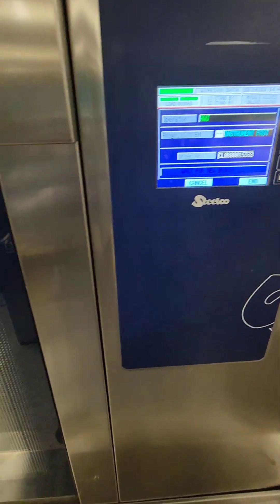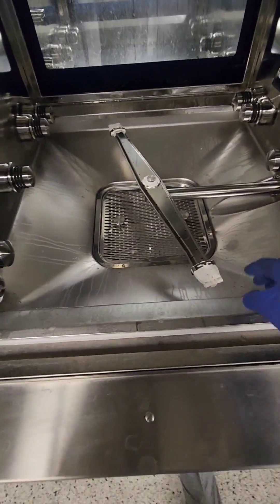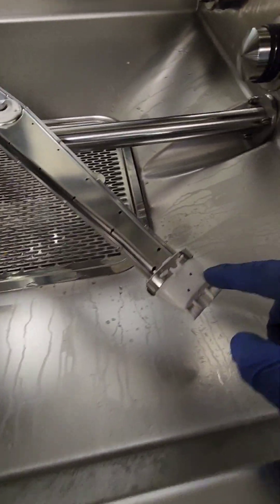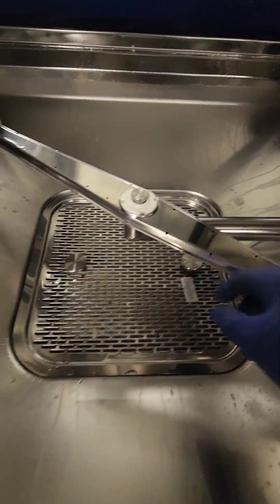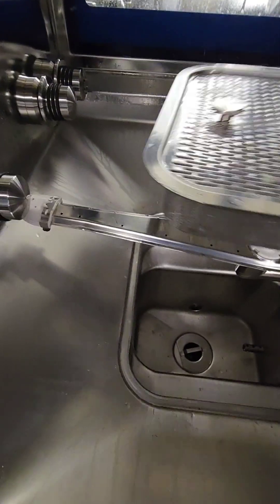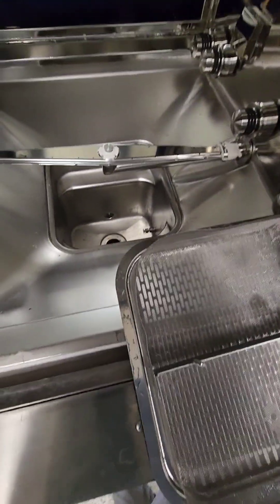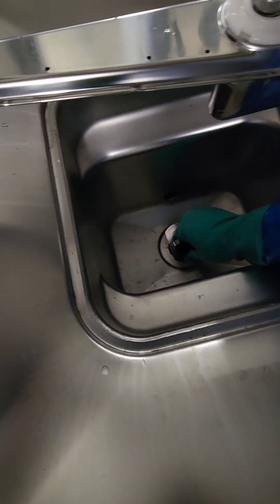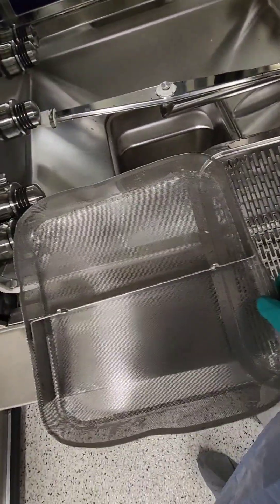Now it's time to check the drain screens on our washer disinfectors — we have four of them. Open the door and first check the spray arms: do they spin freely? The top one should spin freely as well. Make sure there are no clogs in any spray arm, because clogged arms mean ineffective cleaning. They come off easily with a thumb screw. There's a large screen and a small pump drain screen — pull them both out, as they're looking pretty dirty, and take them to the sink to clean thoroughly.